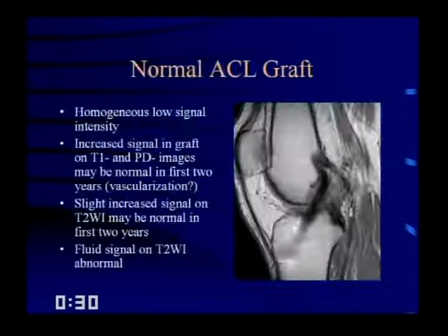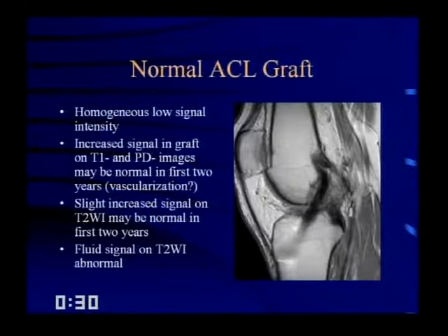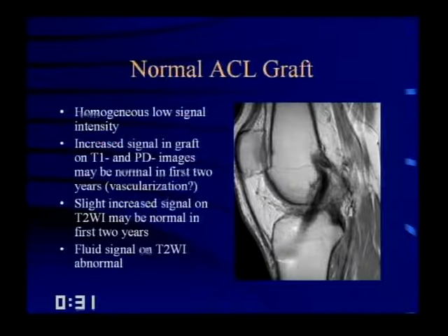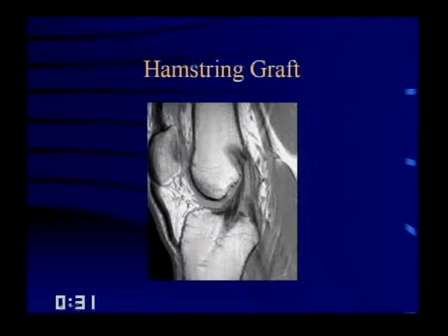A little increased signal intensity in the graft on T1 and proton density images can be normal in the first couple years, thought to be due to vascularization. A very slight increase on T2 can also be normal in the first couple years, but fluid signal intensity on T2 is considered abnormal. Hamstring grafts often have a spiral appearance due to folding — that's completely normal for this graft type.